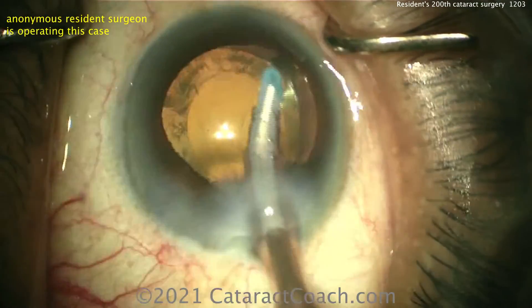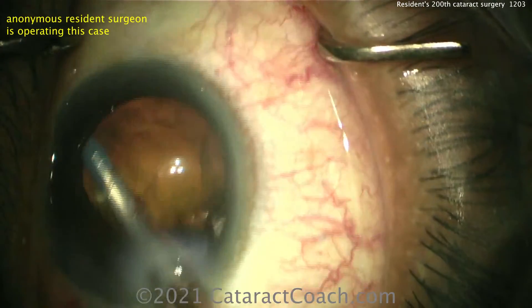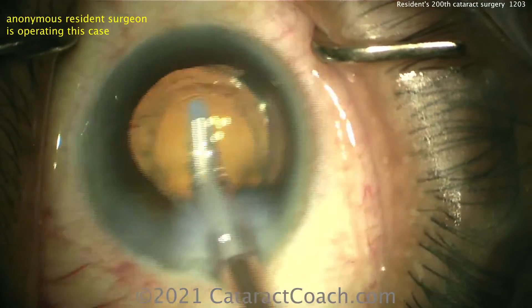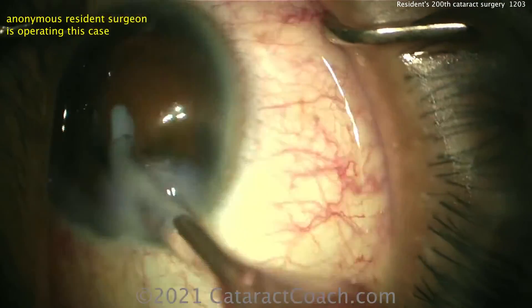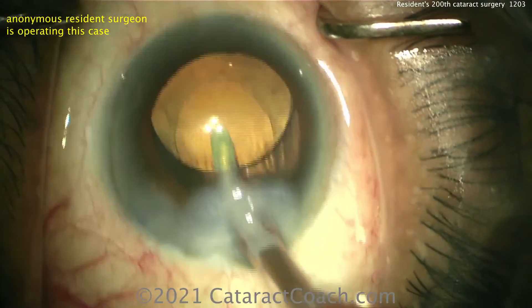Now removing viscoelastic — if you're 200 cases in, you should be able to go behind the optic to remove some viscoelastic. Remember, if you have a toric, EDOF, or trifocal lens, you're going to have to go behind the lens to remove viscoelastic and seat the lens right on the posterior capsule.